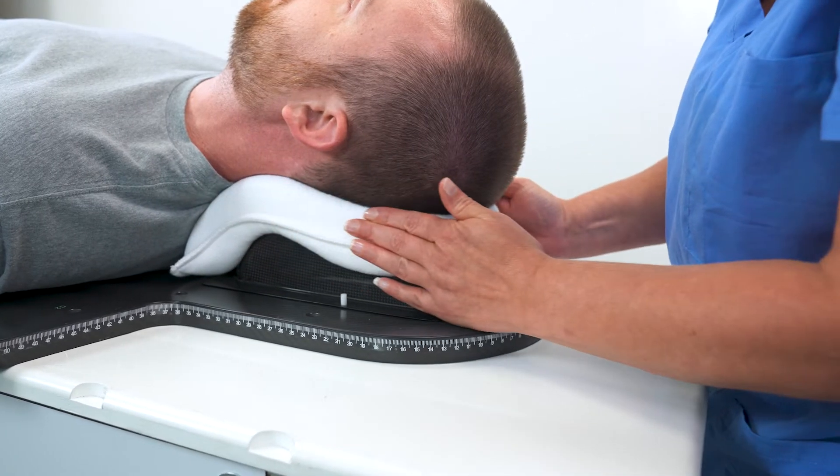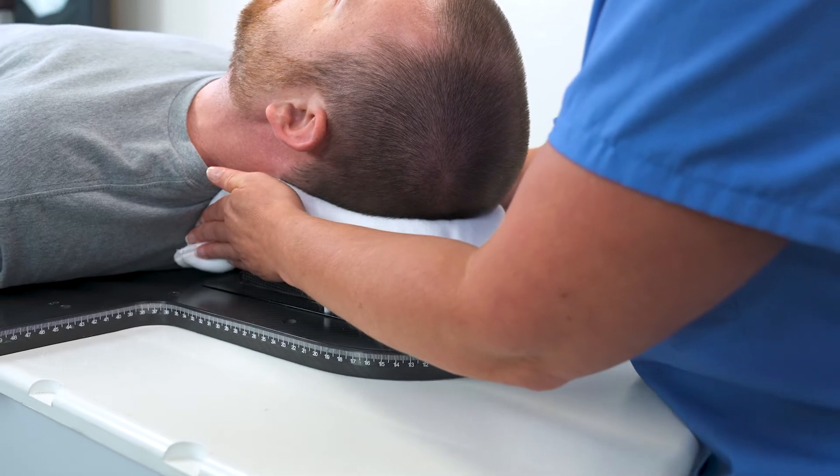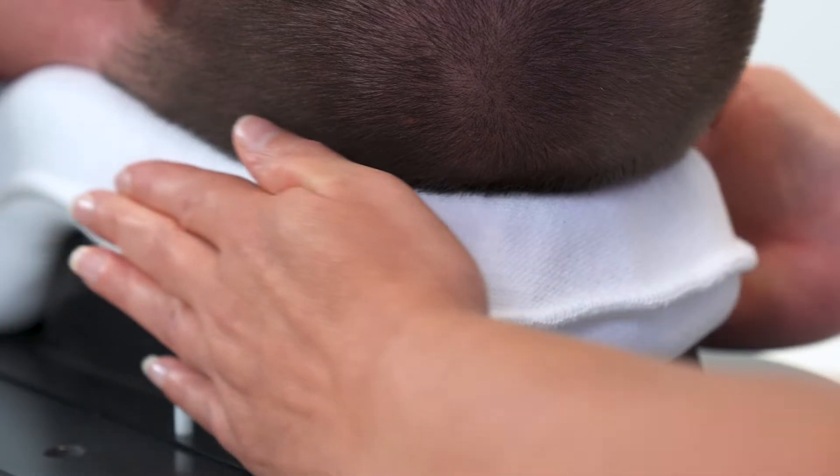It's easy to mold with the optimal amount of working time, which makes for a smooth and comfortable patient experience. The cushion itself is soft and soothing for the patient, and it's incredibly firm and rigid once it sets up for accurate reproducibility.